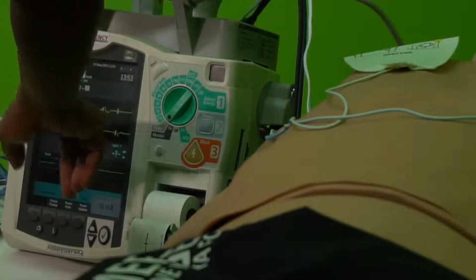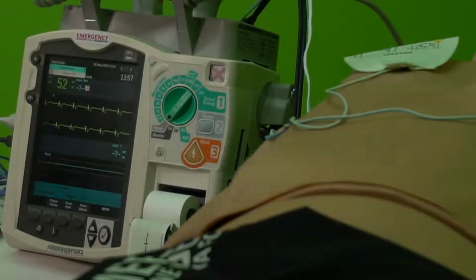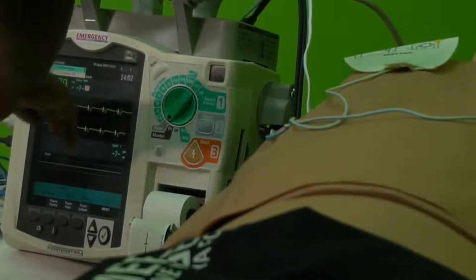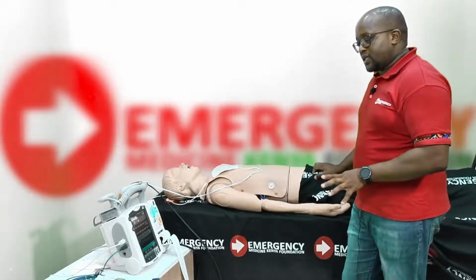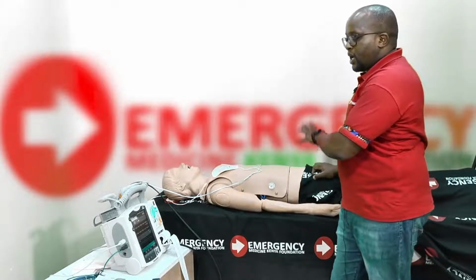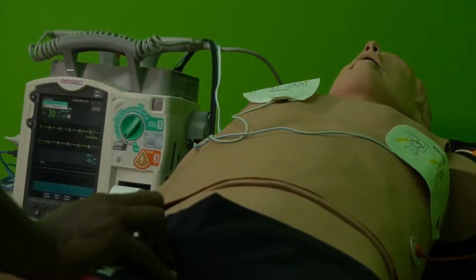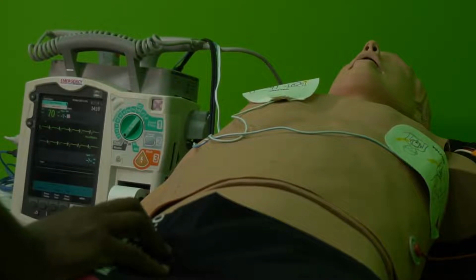Okay, so I have a pacing spike and a wide QRS complex. Every spike is followed by a wide QRS complex. Now I have electrical capture, and I can see my heart rate has gone up to what I had set, which is 70. Now if I come here and check for a pulse, my pulse is still at 38 on the patient's groin. So on the monitor I have electrical capture at 70 beats per minute, but when I check for mechanical capture, I am not feeling a heartbeat at the same rate. So it's probably still at 38. What do I do next?